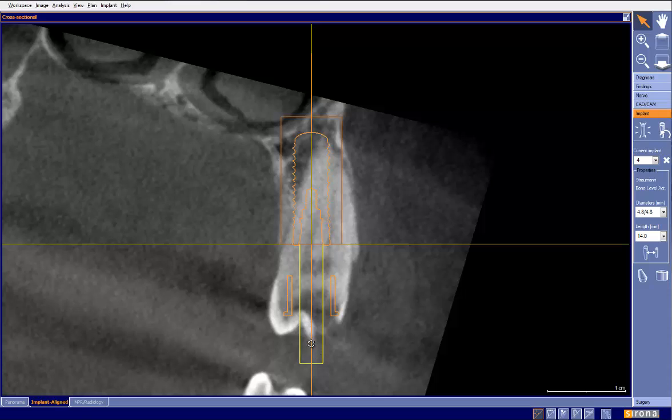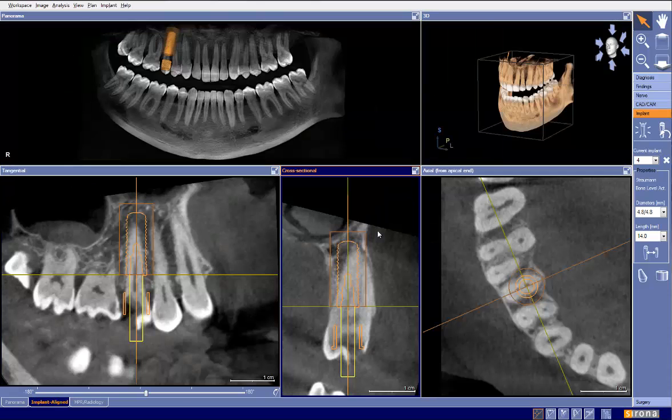Now where's our implant coming out of? Now we're coming out of the buccal cusp. Is that proper loading for this implant? So where do we draw the line of compromising? And those are clinical decisions that I can't make for you.